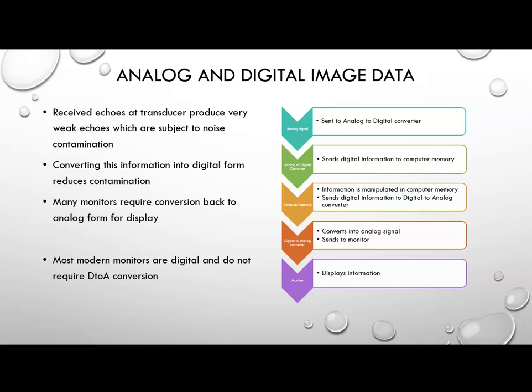And so instead of saying a weak signal or a strong signal, we give that signal that comes to the transducer an actual number. We could measure the voltage and say it has 8 microvolts. Okay, and then we would store in the computer that that echo that came back has 8 microvolts of strength. And some other echo comes back and it might have 10 millivolts or something.